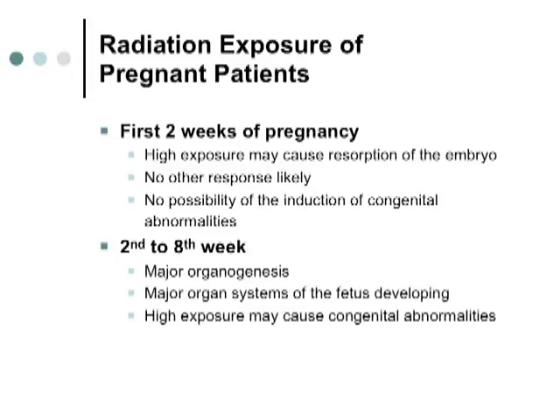Okay, so first 2 weeks of pregnancy, high exposures may cause reabsorption, but otherwise there's no likely response that we're going to see. 2nd to 8th week is a very sensitive time during organogenesis, and you want to avoid that. We always want to ask patients, is there any possibility they could be pregnant before we do a high dose exposure like fluoroscopy or a CT scan. Chest x-ray, we do x-ray women that are pregnant with chest x-rays because it's a very high KVP, very low absorption, and we can shield them with an apron when we're doing that.